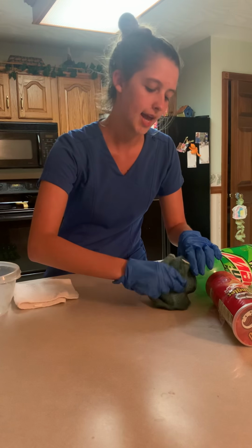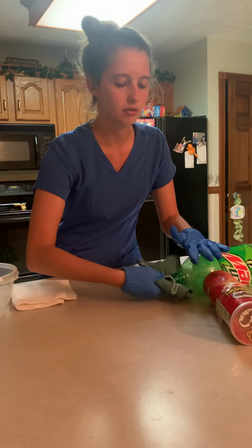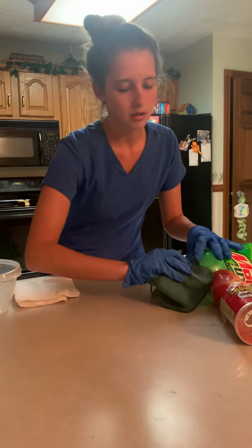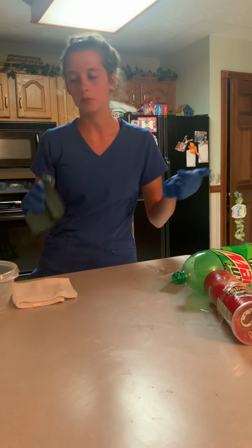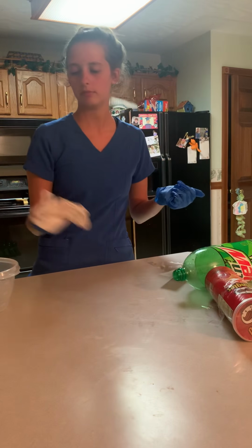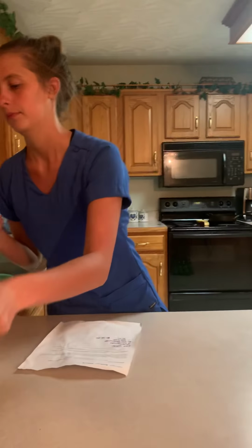We're going to clean around the head of the penis in a circular motion, with a different part of our rag. We're going to clean around the shaft of the penis in a circular motion, and then we're going to go around the scrotum in a circular motion with a new part of the rag. And then we will pat dry if needed. Then we're going to remove our gloves, and we're going to wash our hands.